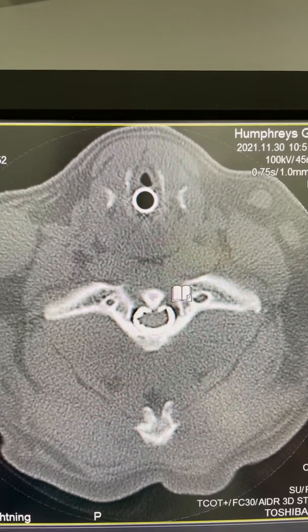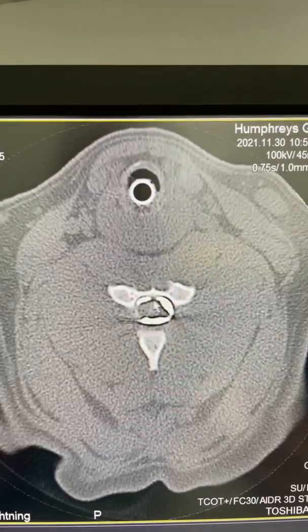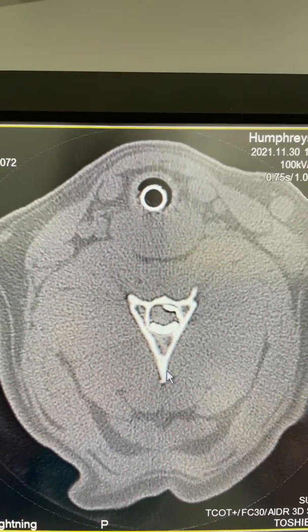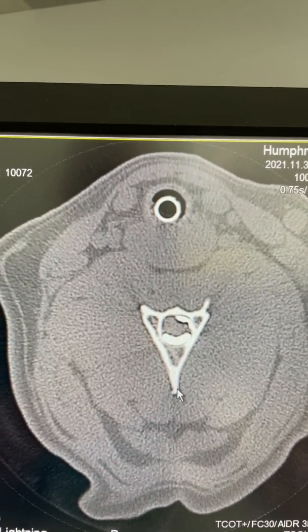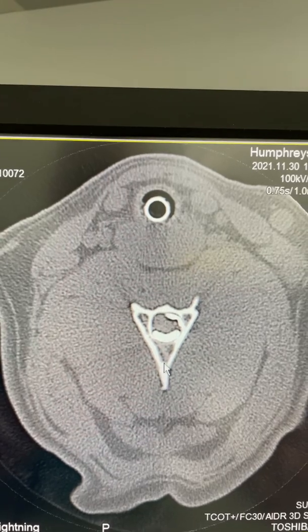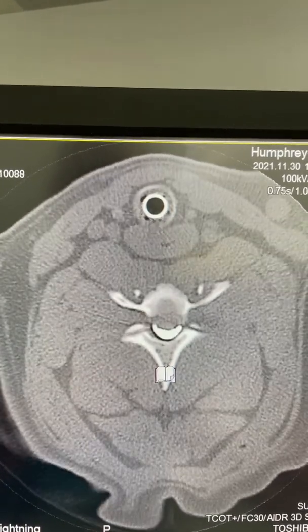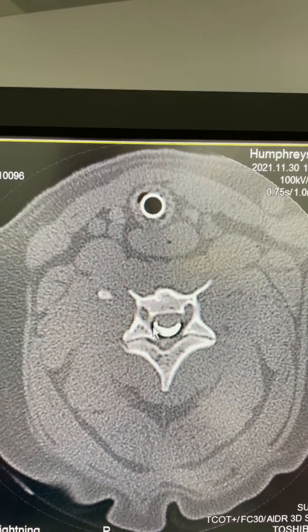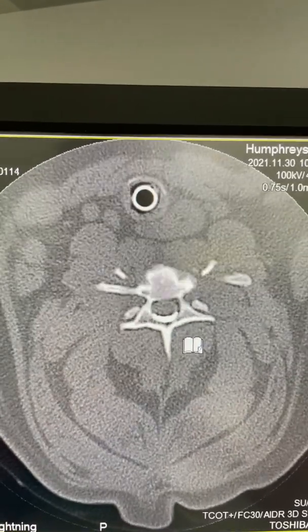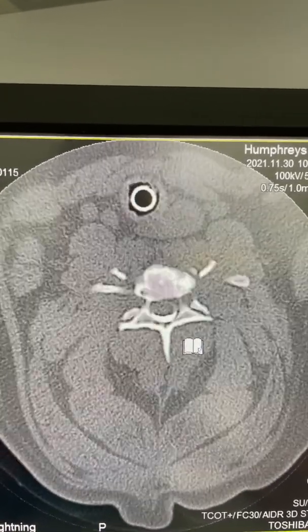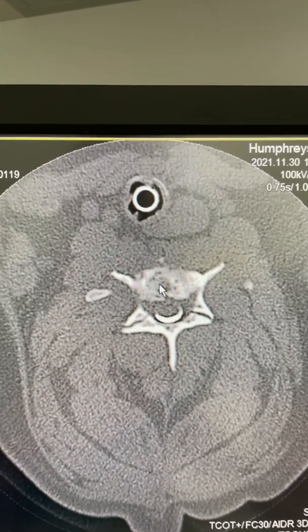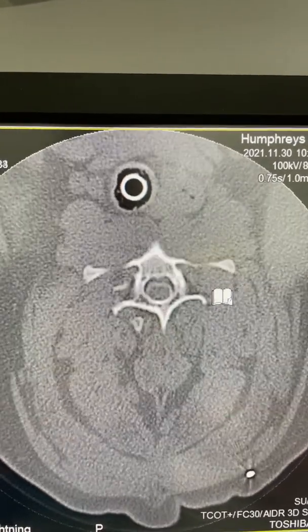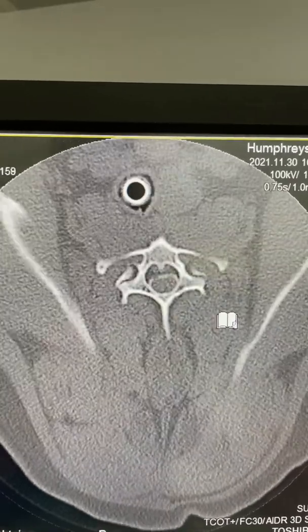Heading back, you can see myelographic contrast surrounding the spinal cord. This is C2 right here, which has a typical triangular — isosceles triangle — appearance with a very prominent spinous process. Heading cranially, this is C3, and we can see good myelographic contrast dorsal to the spinal cord. These little pitting areas near the vertebral end plate are actually fairly normal — we see these frequently in dogs. Heading back further, still all normal.